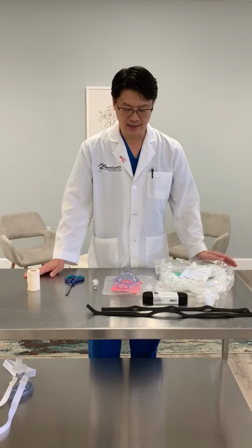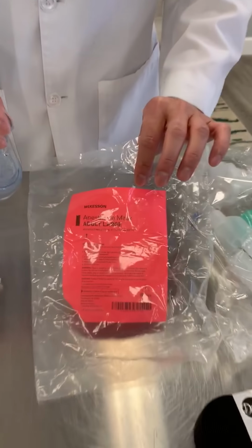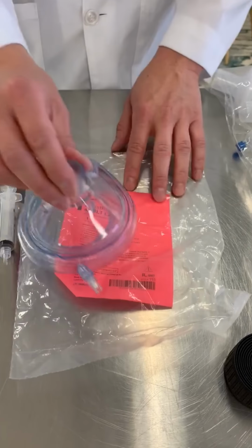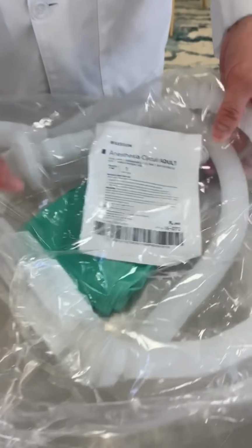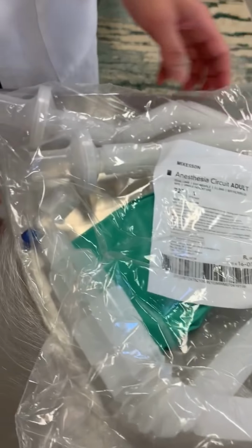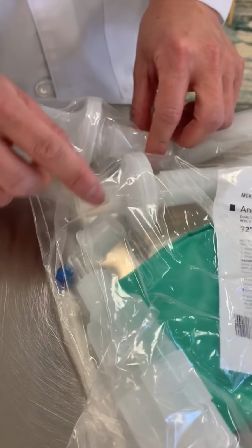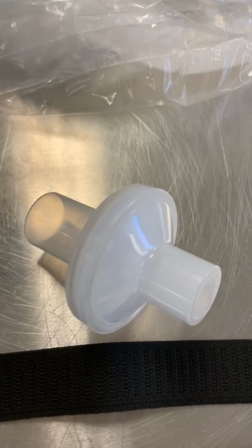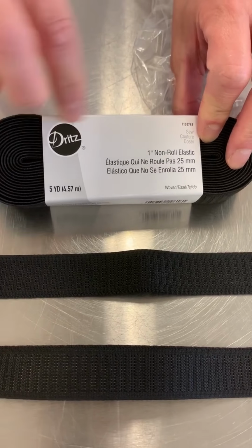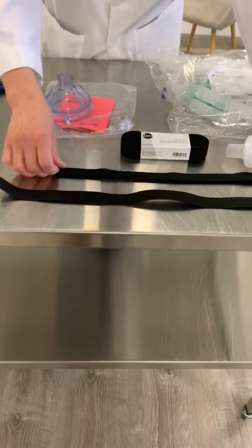Here are the supplies that you will need. First, you will need an adult large anesthesia mask. You can also use a medium size as well. We took an anesthesia circuit that's adult size, and on it has two BV filters, bacterial and antiviral filters. This is an elastic that we bought from Walmart. It's 1-inch, and you just cut it to the size that you need.